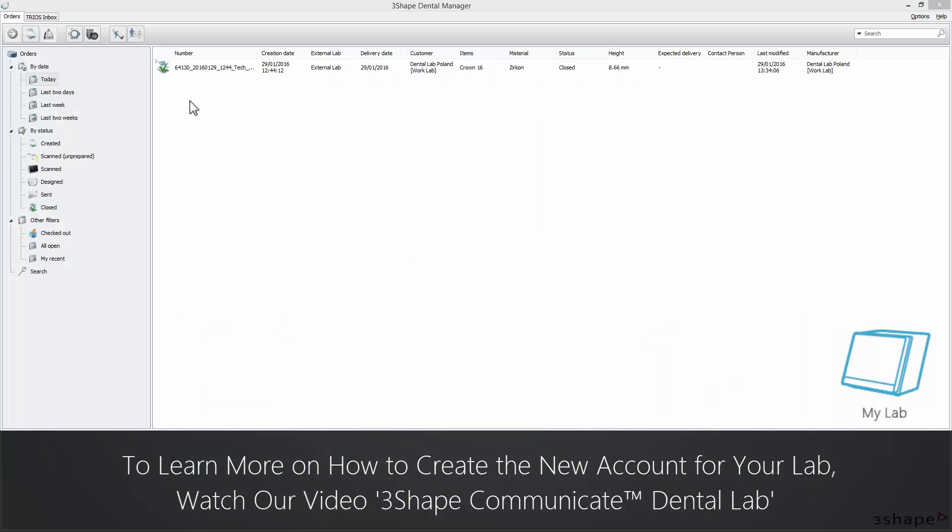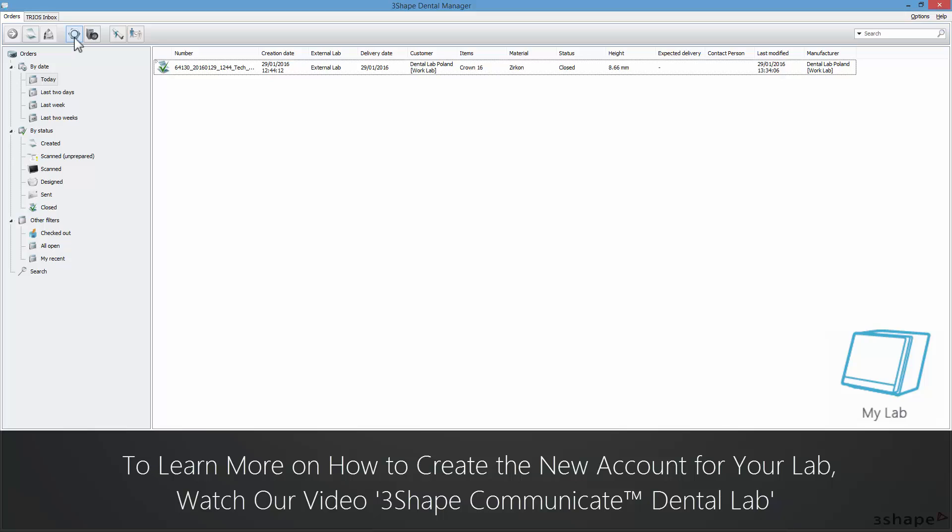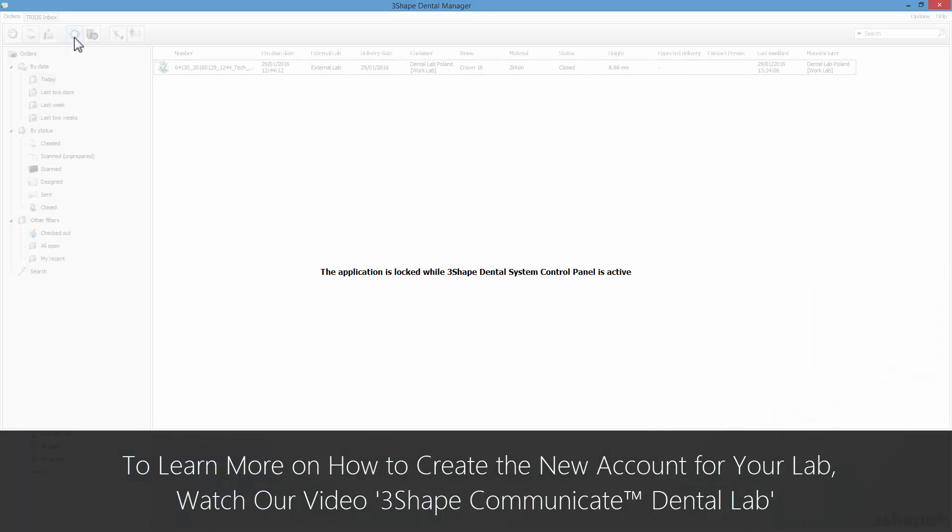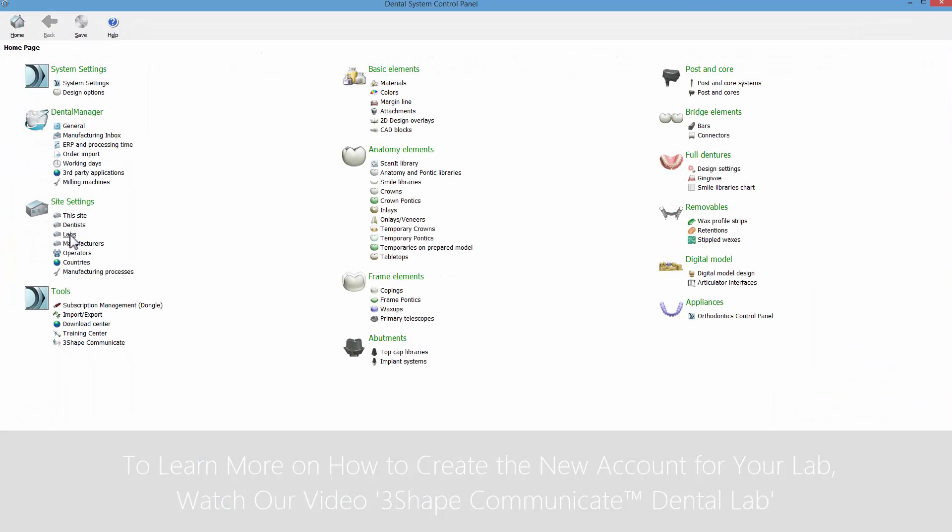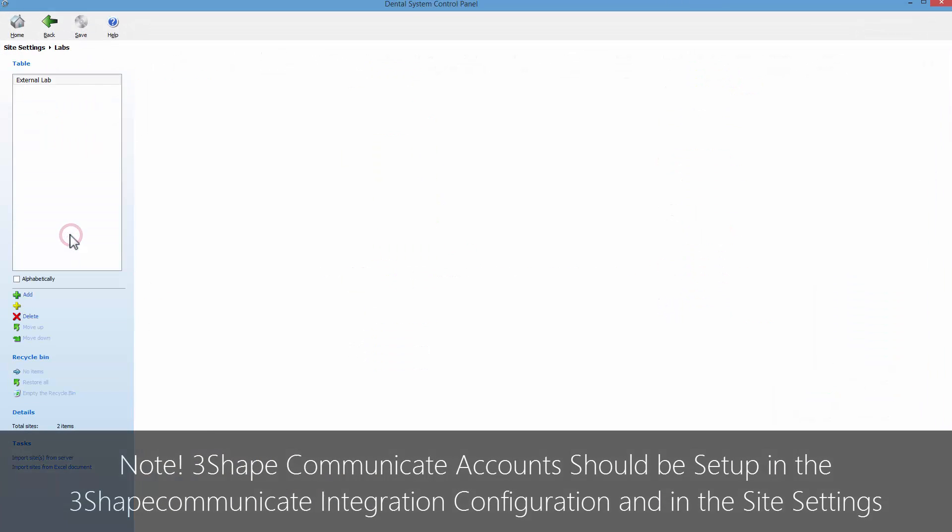To send and receive orders through 3Shape Communicate, remember to set all the details for your account in the Dental System control panel.